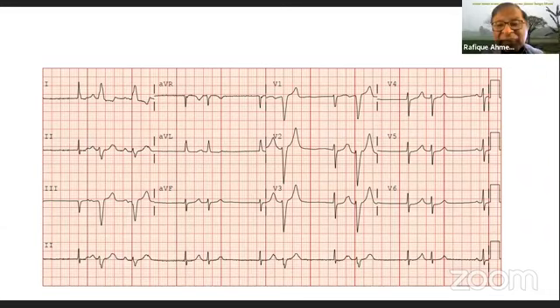Yes, but look at the P wave in the T wave. So even though the assumption was that this wide beat is a ventricular premature, it is not. It's actually a supraventricular rhythm. The P wave is clearly notched, and you can see the P wave in lead 1, lead 2, lead 3.